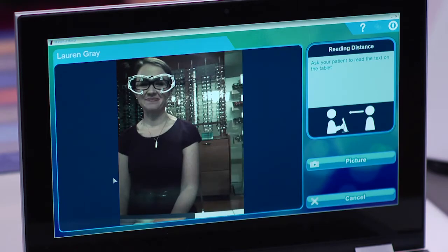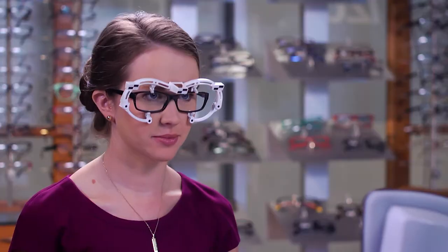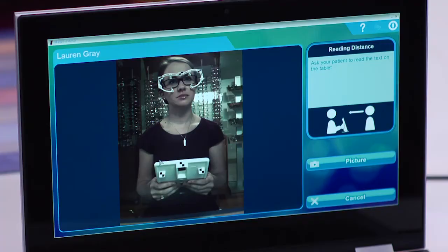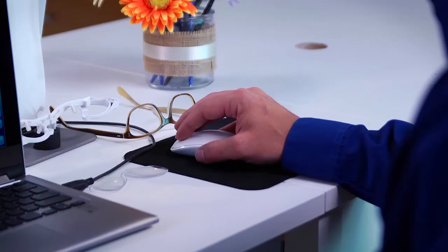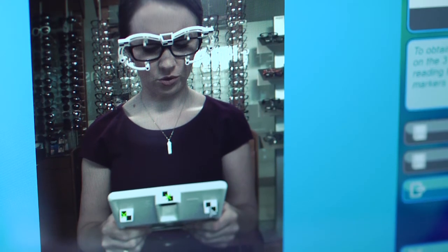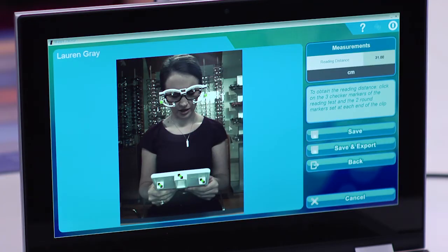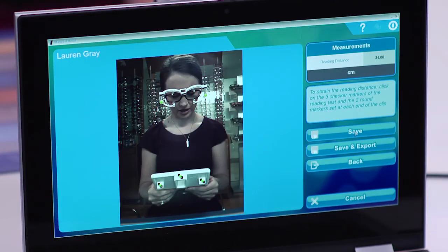Click on the reading distance icon and hand the tablet to your patient. The patient should be wearing their own frame with the previous correction and with the clip properly positioned. Adjust the angle of the mirror and the distance between the mirror and the patient until the frame clip and tablet sensors are visible. Ask the patient to hold the tablet comfortably and read the text out loud, as if she were holding a book. Then press the camera or video icon to start the measurement. Click on the three checkerboard markers on the tablet and click on the two black circles located at each end of the clip. The reading distance will be displayed on the screen. Click on the save icon to save the measurement and return to the home page.